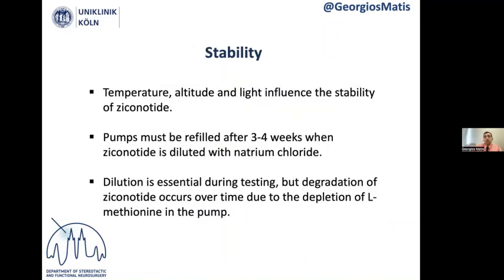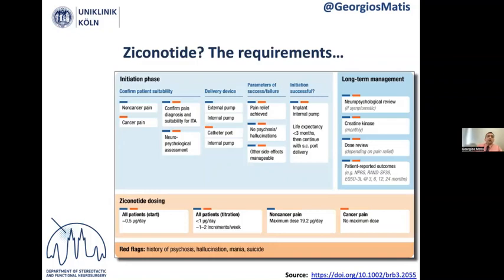Some issues: we know that the temperature, the altitude, and the light influence the stability of the drug. This is why the pumps must be refilled every 3 to 4 weeks when the drug is diluted with sodium chloride. Dilution is essential during the testing, but degradation of Ziconotide occurs over time due to the depletion of L-methionine in the pump. This graphic comes from the article that I showed you, which was published in Brain.